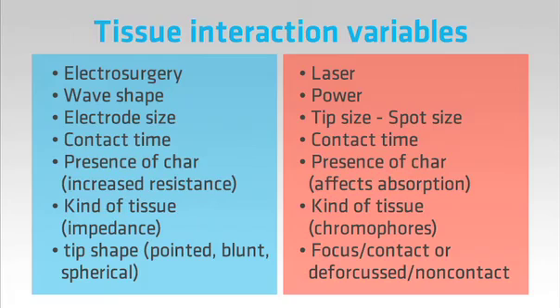They become hot, our special trick for handling bleeders. With electrosurgery, the impedance changes between different types of tissue, and we can't gauge that difference. With the laser, the hemoglobin and water differs only slightly between tissues, and we can see that because tissues with more hemoglobin have a deeper red color.